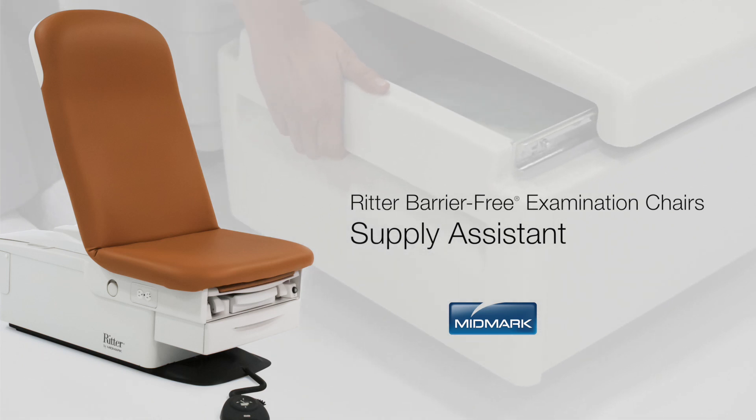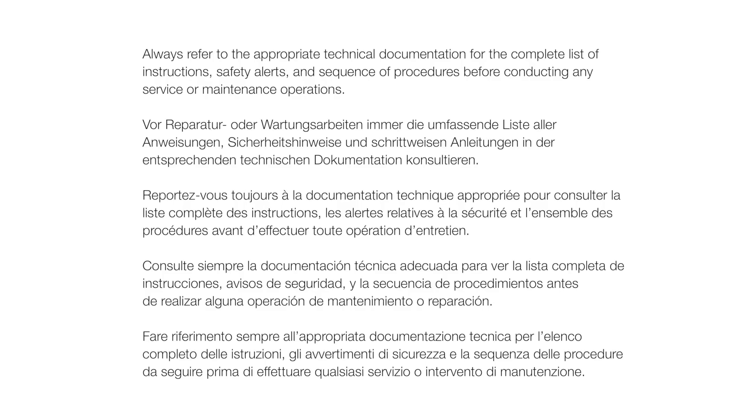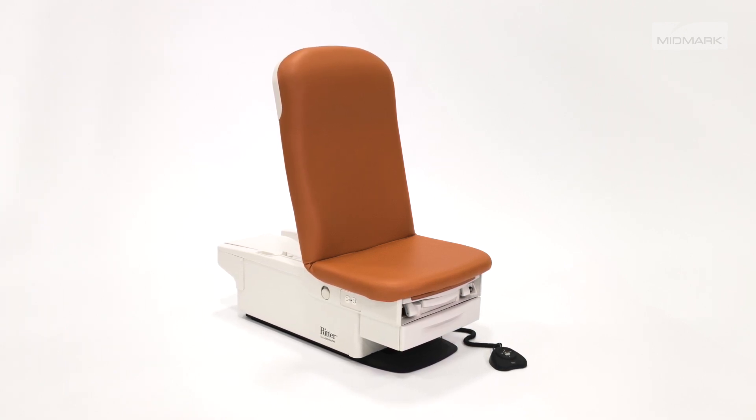This video is an overview of the Supply Assistant accessory for Ritter Barrier-Free Examination Chairs. Always refer to the appropriate technical documentation for the complete list of instructions, safety alerts, and sequence of procedures before conducting any service or maintenance operations.